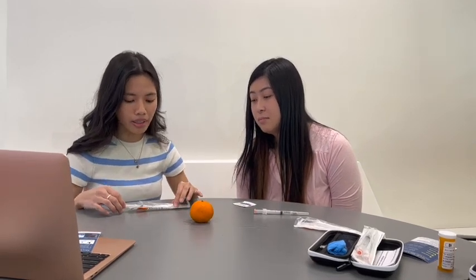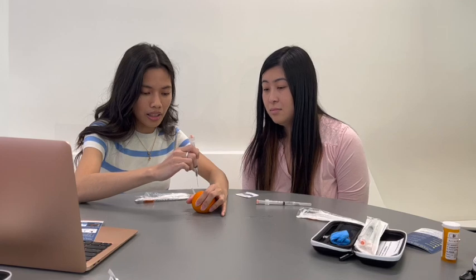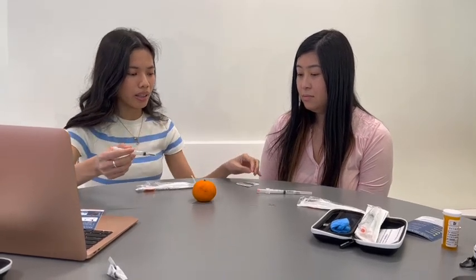So, we have an alcohol swab here, which we could use to disinfect the skin area. But in an emergency situation, feel free to skip that part because we're in a hurry. So now I'm gonna pretend that this is your large muscle, and I'll show you how to inject the medication in. So you'll take your syringe out, and then you have to angle it in a 90-degree angle, and then you just inject it on the client's large muscle, and then push everything in, administer the dose, and then after that you have to engage the safety. It's done. So you've engaged the safety cap.